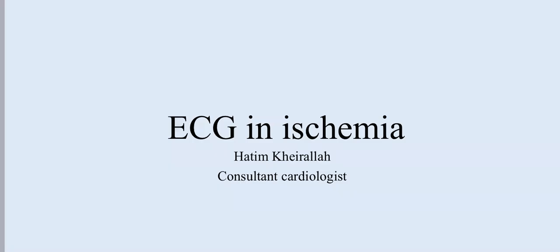Okay, ECG in ischemia. Of course, the fragmentation of ECG into ischemia, arrhythmia, and stuff like that might not be appropriate in the exam. In the exam, you are confronted by a bunch of ECGs and you don't know. But now we have determined the theme of this ECG as such. So things will be a bit different.